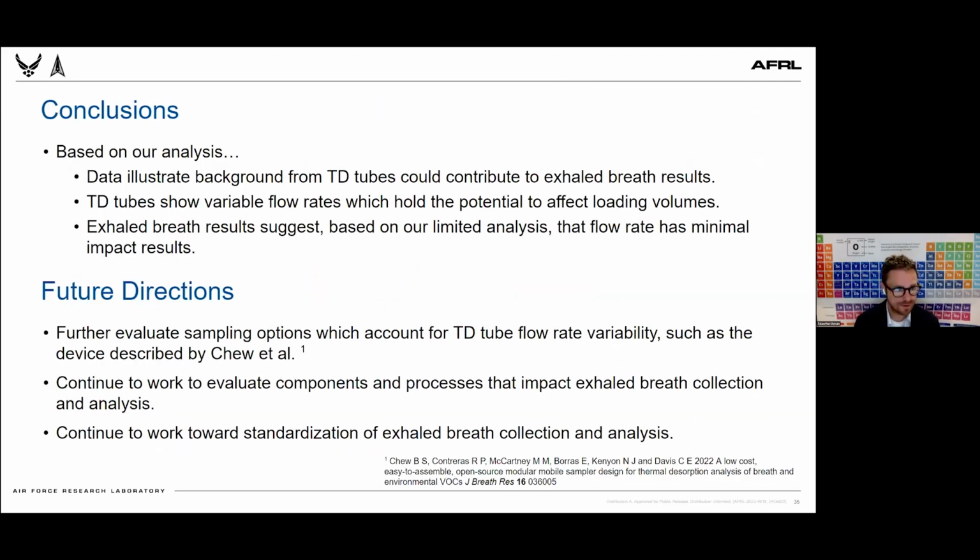One of the things I wanted to go back to with the background data is that we tested our systems. I believe that people who use these should evaluate their own systems, their own blanks and their own background, to see how they can contribute to their exhaled breath results. While the TD tubes show variable flow rates, exhaled breath doesn't seem to be impacted. And we're not totally sure why.